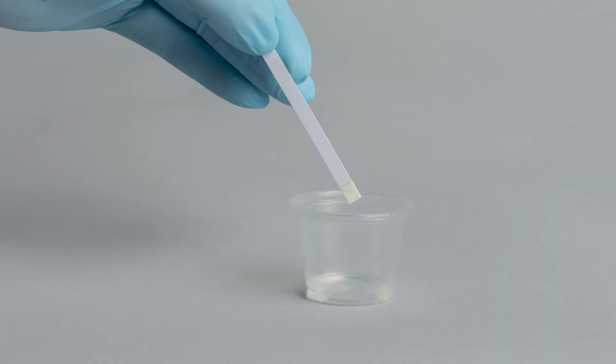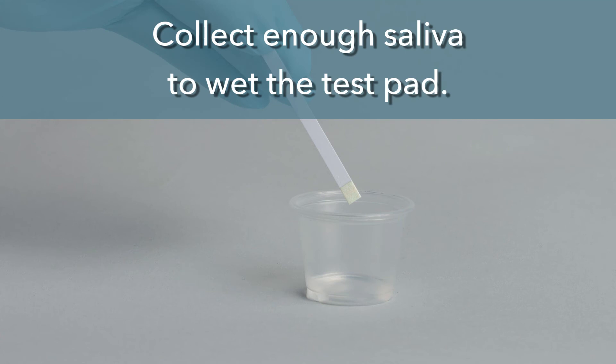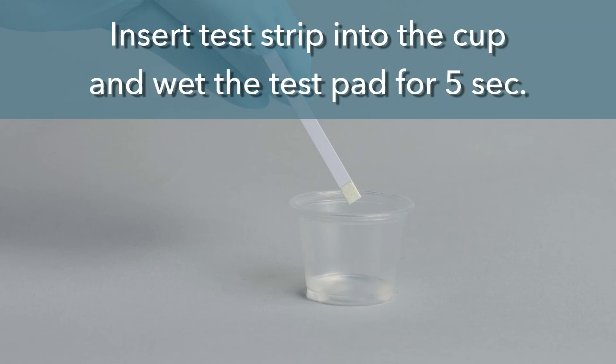Using a clean, dry, 1-ounce solo cup, have the donor spit into the cup, making sure you collect enough saliva to wet the test pad. Next, insert the test strip into the cup and wet the test pad with the saliva for 5 seconds.